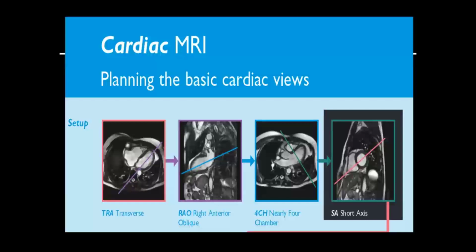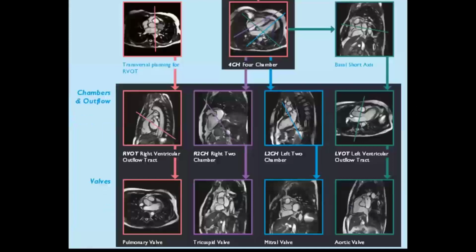The second thing is that in cardiac MRI, you can look at the heart in different views, in any view actually you want. Two chamber, four chamber, three chamber, short axis. In three chamber you see the left ventricle, left atrium, aorta. In two chamber you see left ventricle, left atrium. So whatever you want, you can get the image that you want, and you can even create your own valvular planimetry image from just planning the views.